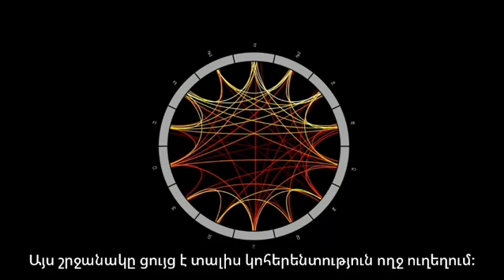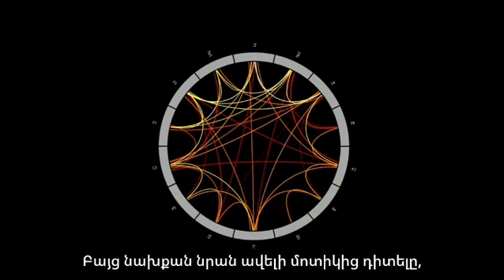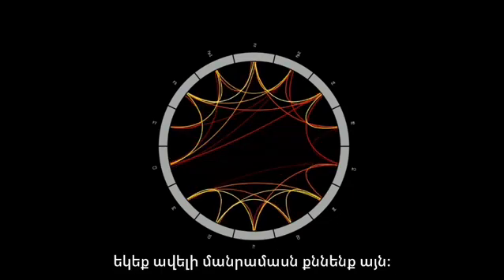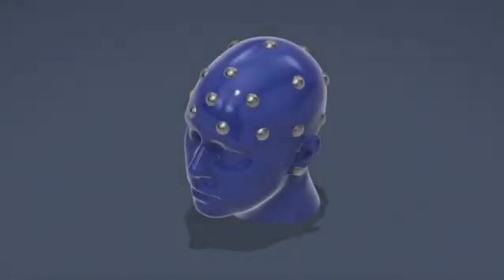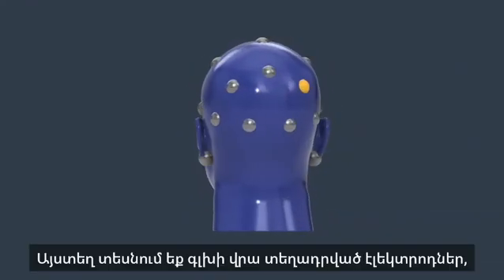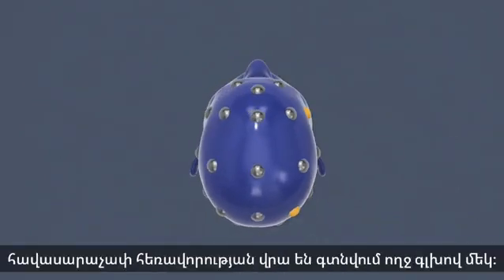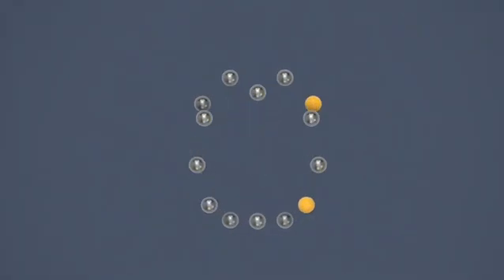This circle shows coherence in the whole brain. But before we look at it closer, let us first learn more about it. Here we have the head. Placed on it are electrodes. They are evenly spaced and they cover the whole head.